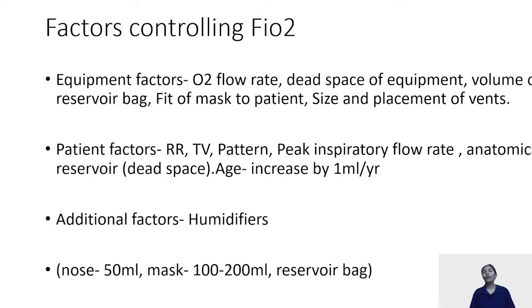Talking about one more very important factor: how the fraction of inspired oxygen that goes to the patient is controlled. Now, it can be controlled via two factors. One is your equipment factors and the other is the patient factor. The equipment factor is how much flow rate of oxygen you have opened first.